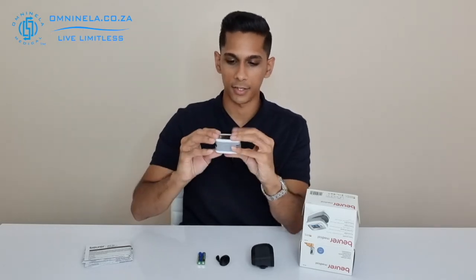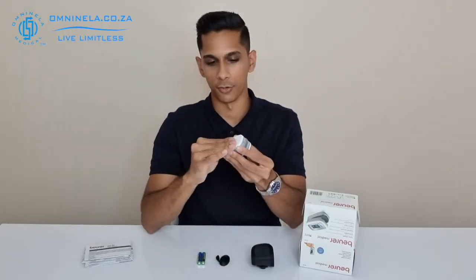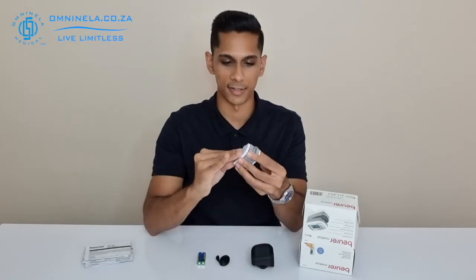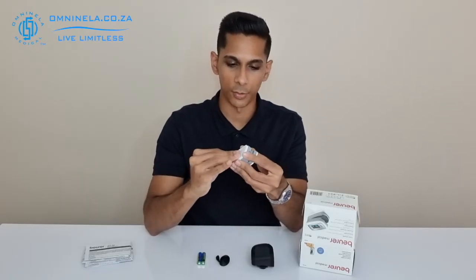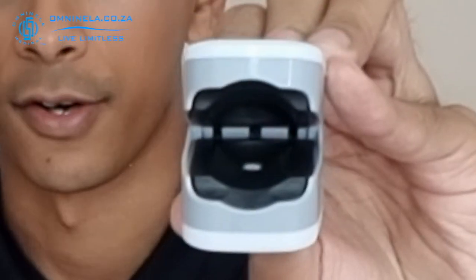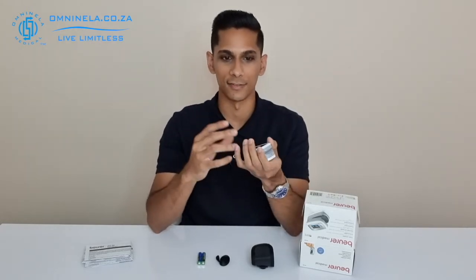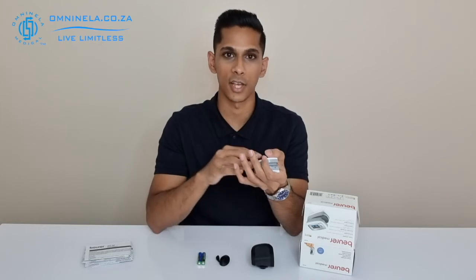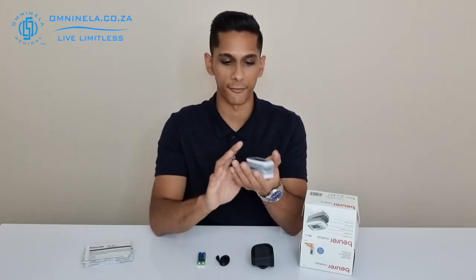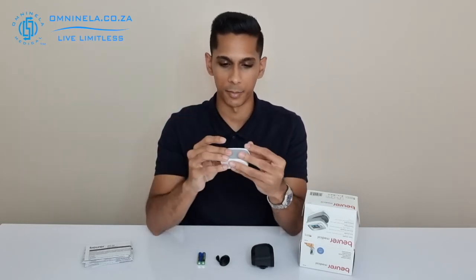You're going to have the screen on the front side and that will display all of your readings, and on the back side you've got your port that you'll put your two triple-A batteries into. On the inside of the device we can notice that we've got a rubber material, which is nice if you are someone who has sensitive skin or needs to wear this for a long period of time — the rubber will be able to mold to your finger shape instead of the plastic interiors you might find on other brands.